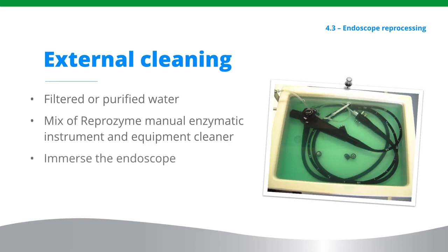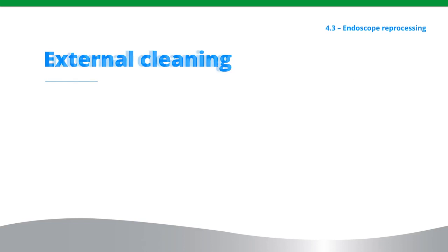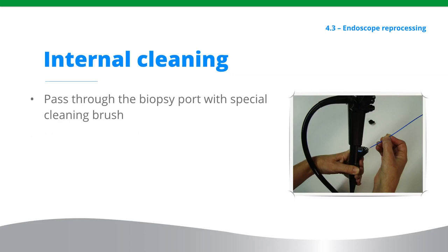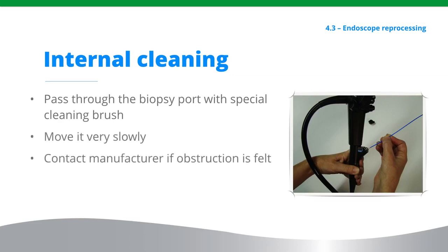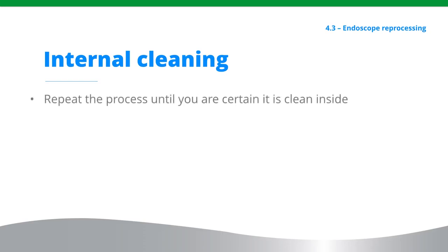Immerse the endoscope completely. Wash in detail with disposable, non-lint wipes and cotton buds. After straightening the flexible tip of the endoscope, use the special cleaning brush supplied with the instrument to pass through the biopsy port, moving it very slowly. Contact the manufacturer if an obstruction is felt. When the endoscope emerges from the tip, wash it thoroughly and pull back to the beginning. Repeat the process until you are certain it is clean inside.